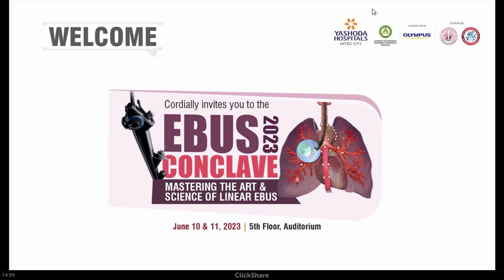With multiple nodes, we will first screen all the nodes. We will see all the nodes. Whichever node is least vascular and the largest is the one which is usually sampled first.